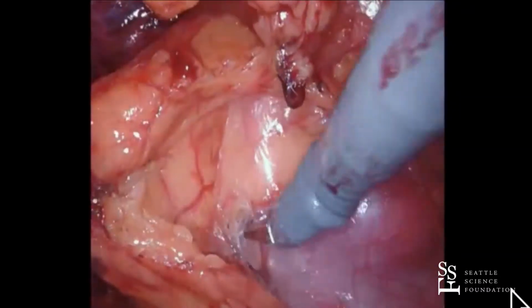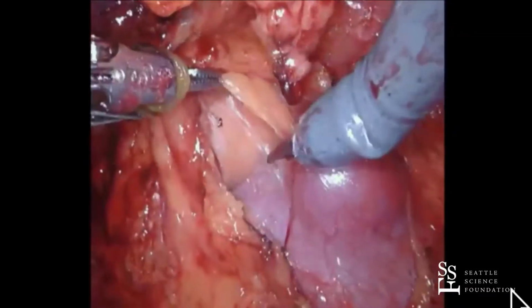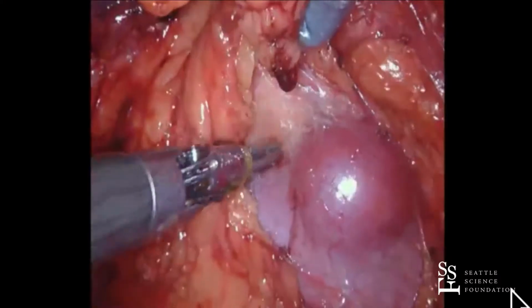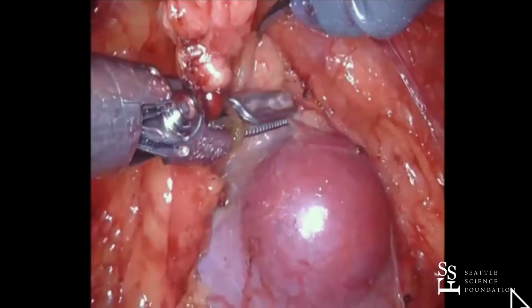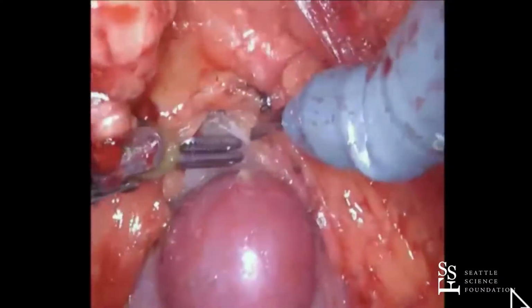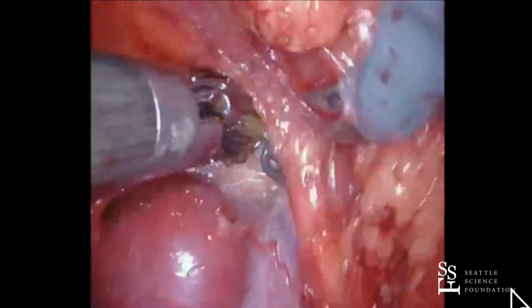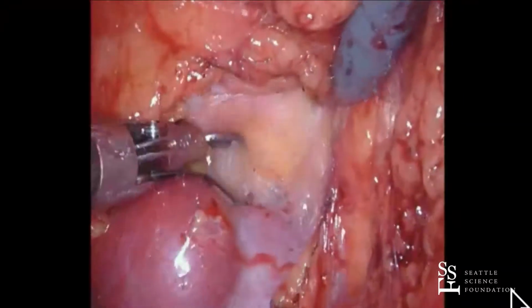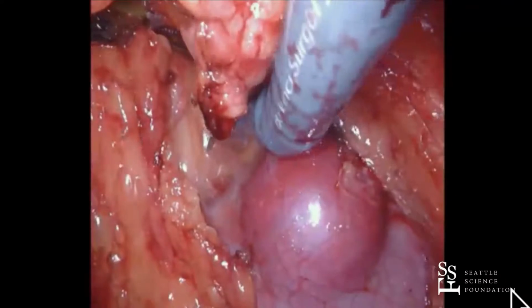Just for the sake of full disclosure, we did offer this patient renal mass biopsy, and she declined. She wants it out. We talked about the potential benefit, and she said, no, I just want you to get it out of me. I don't want this tumor. I don't want more imaging. I want it out. Ronnie biopsies all of his tumors. Yeah, I'm going to talk about biopsy later today. I would agree. She's a relatively young patient, it looks like. So you're going to give her a lifetime of surveillance and scans versus just plucking it out of there. It's an easy partial. The complication rate is low. Her postoperative morbidity is going to be minimal. So I think this would be one to go straight to partial nephrectomy.